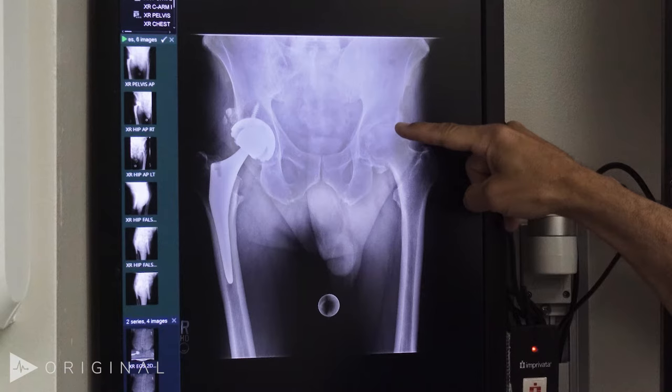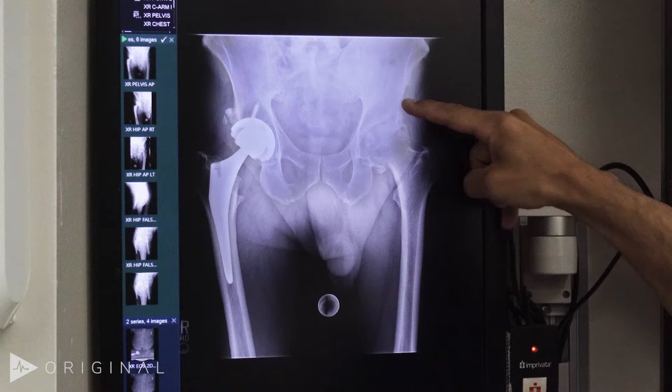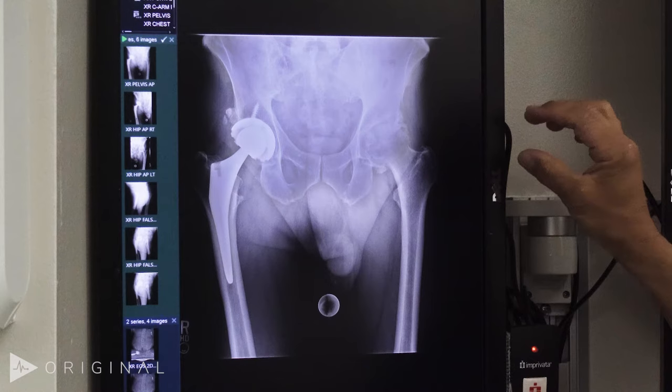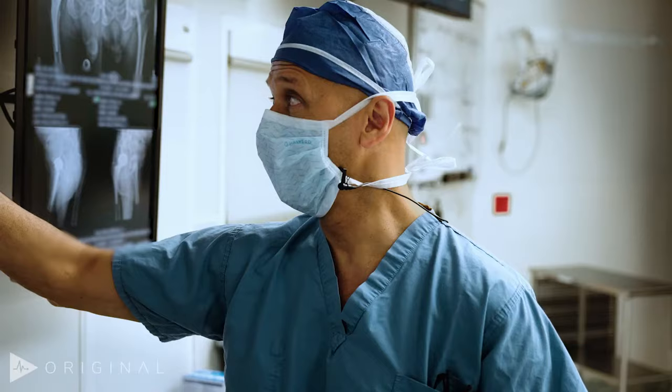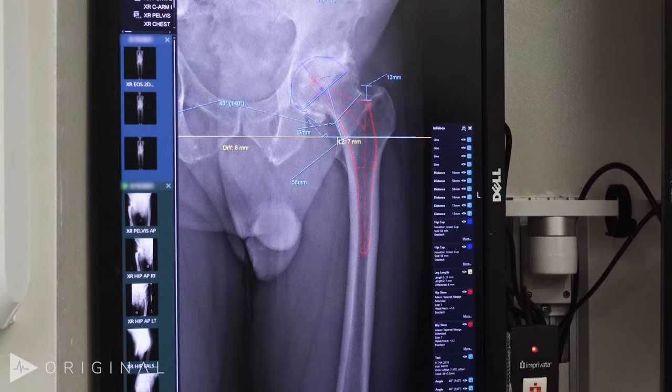Clearly this is a bone-on-bone situation where there is no longer any superior cartilage. We can see this is his anterior inferior iliac spine. That's important because it's in a very lateral position, which means the muscle that attaches to it — the rectus femoris — is going to be in a much more lateral position, which effectively deepens the hip.